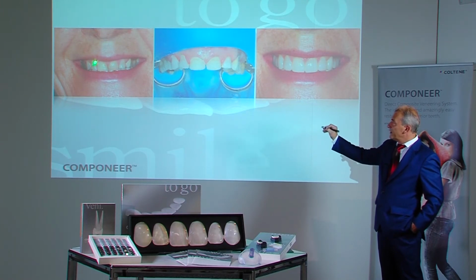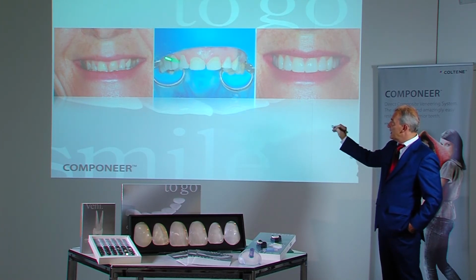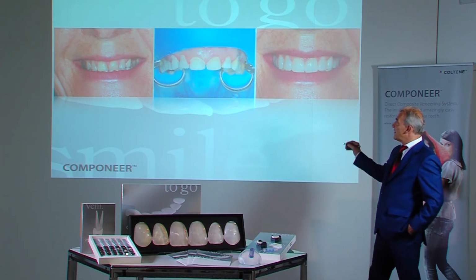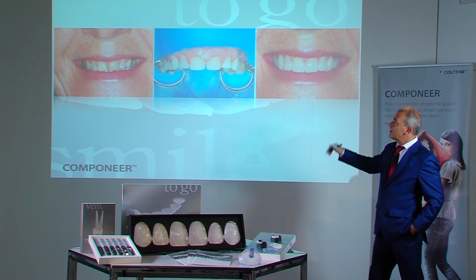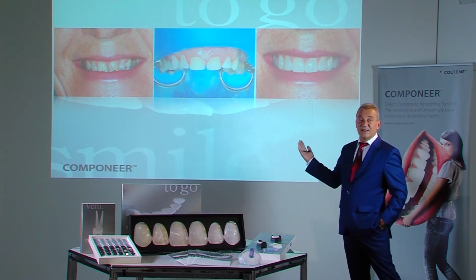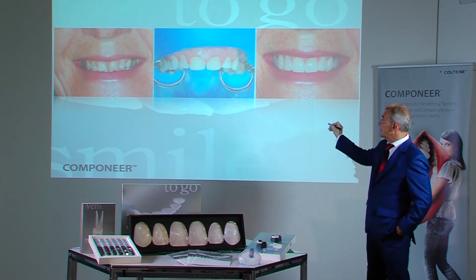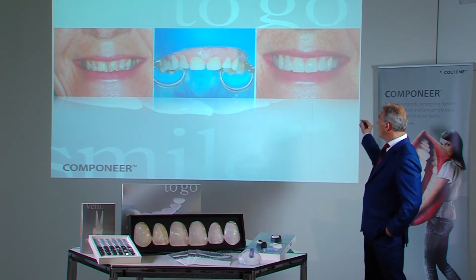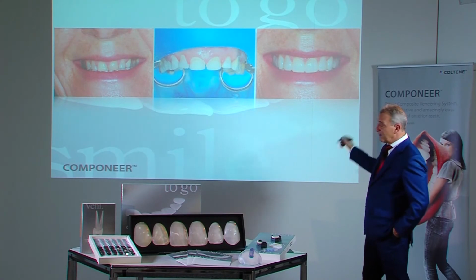Here we can see the preparation again. The irregularities were roughened slightly and reduced slightly on the surface. No preparation was performed outside the central incisors. Only sandblasting and etching were performed to align and fill this dental arch.